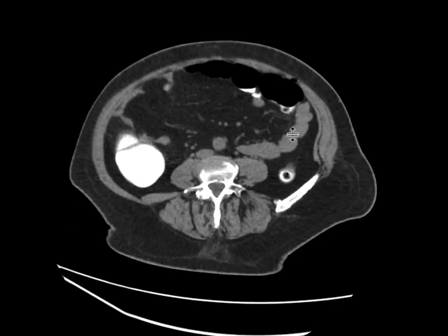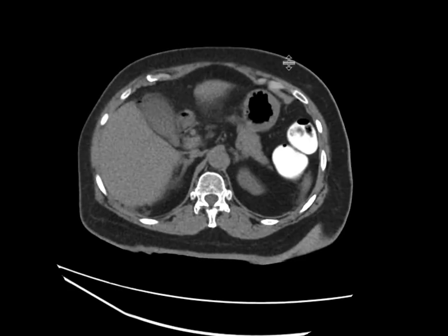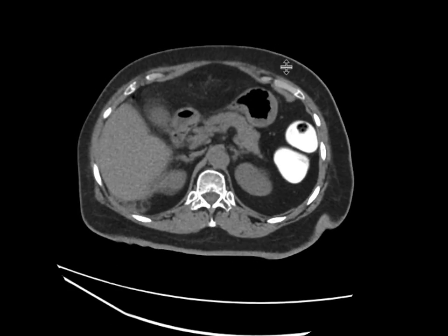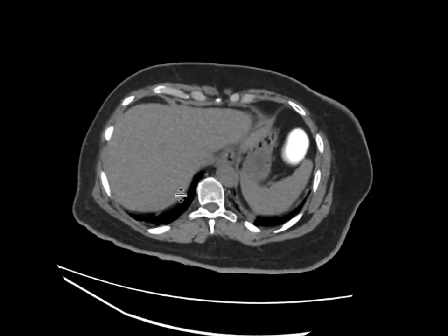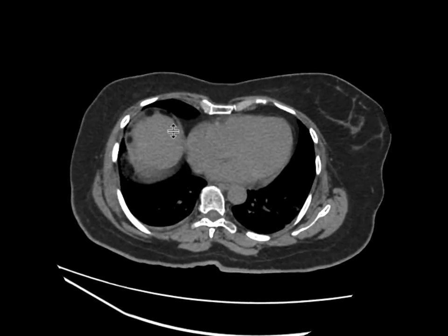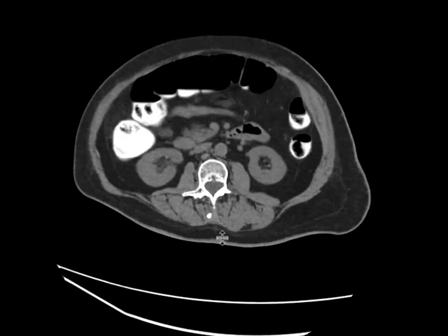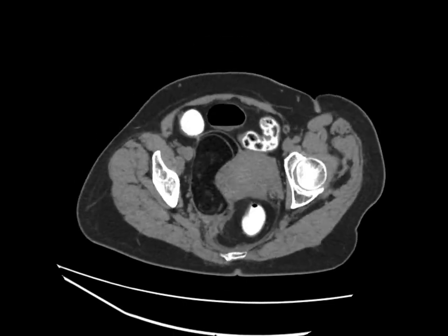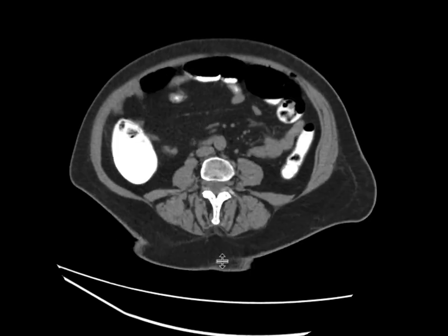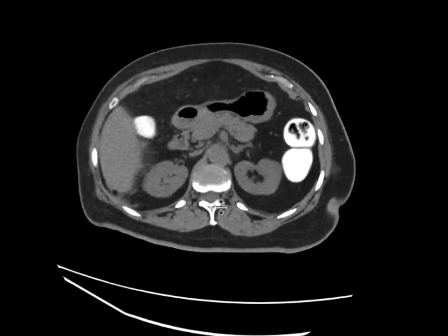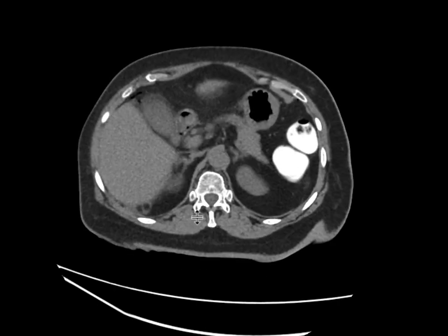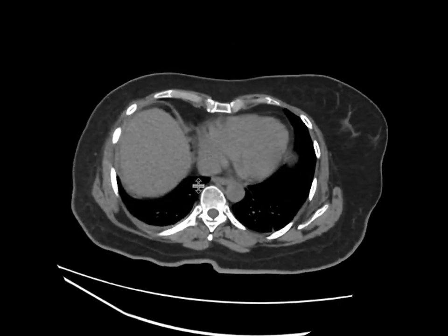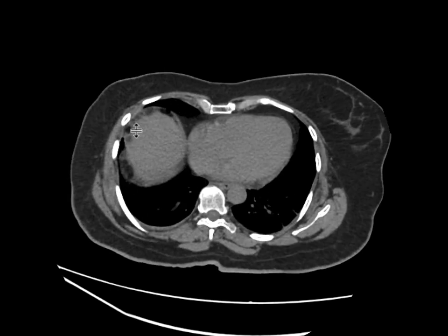But if we go upwards and look cephalad to the subdiaphragmatic space as well as the hepatorenal recess, we start to see these very discrete locules of fat situated in that location. Going all the way up, you can see discrete foci of fat in the right subdiaphragmatic space. These constellation of findings are characteristic of a ruptured ovarian dermoid, with fatty deposits rupturing and depositing in the dependent portions of the peritoneum in the hepatorenal recess, as well as going all the way upwards to the right subdiaphragmatic space.